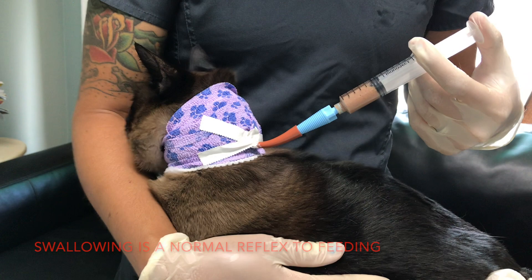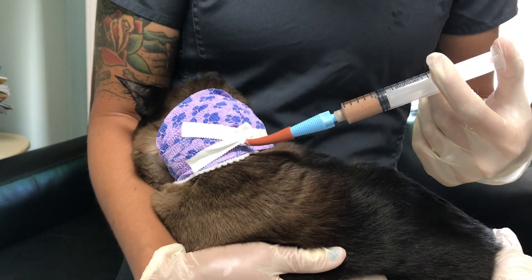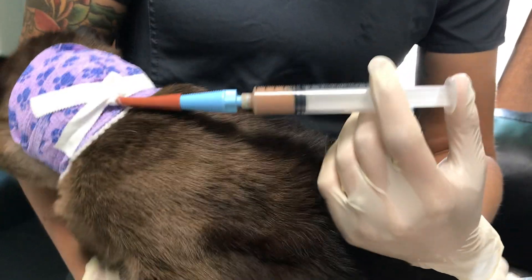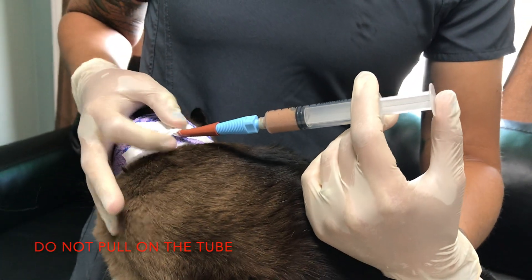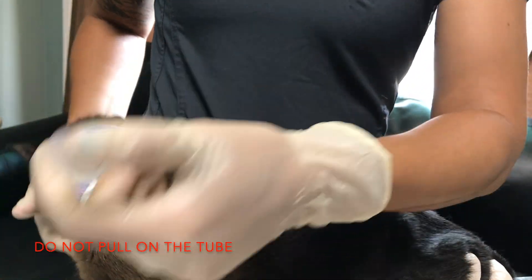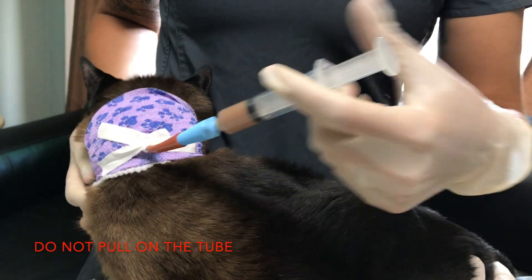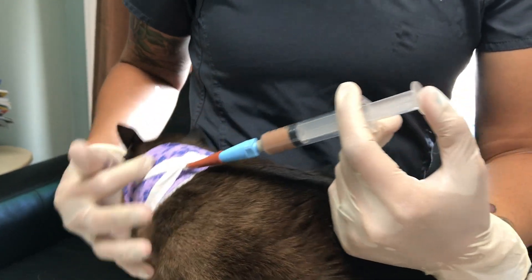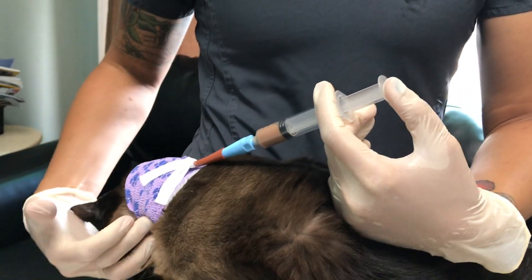As you can see, he is still swallowing for us as I push a little bit of food in each time. The tube doesn't actually directly go into his neck at this point — it does curl around to allow us to wiggle, so when he moves it's not directly attached to his neck. It's nice and curled up in here before it goes into his neck down in here.